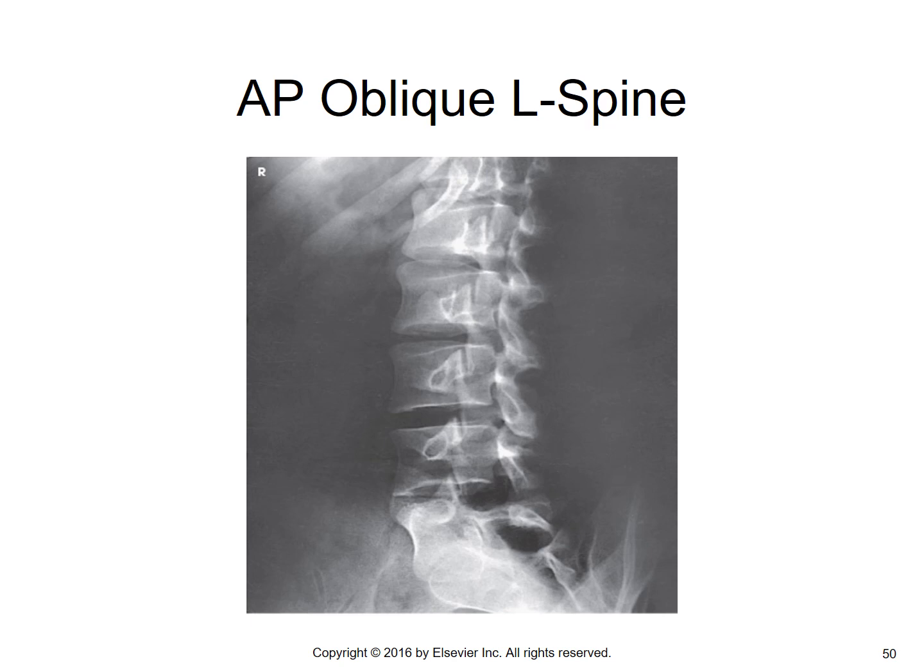Also look at the eye of the Scotty dog as it relates to the vertebral body. The eye of the Scotty dog should be right in the middle of that vertebral body.